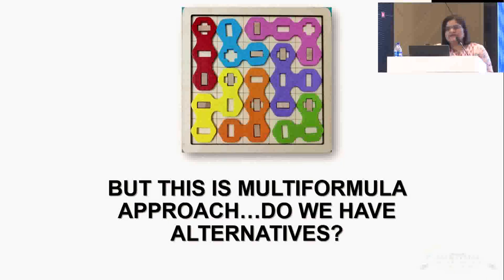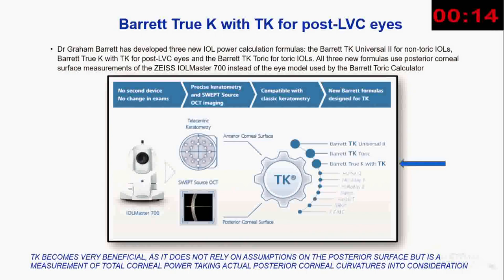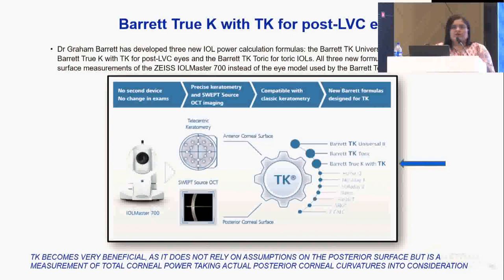We can go to the Barrett True-K formula, which we have already spoken about. And TK is very beneficial because it does not rely on assumptions on the posterior surface, but is a measurement of total corneal power, taking actual posterior corneal curvatures into consideration. Now, with this TK, we have three formulas, that is Barrett TK Universal 2, Barrett TK Toric, and Barrett True-K with TK. But do you think that only one machine has this? No.